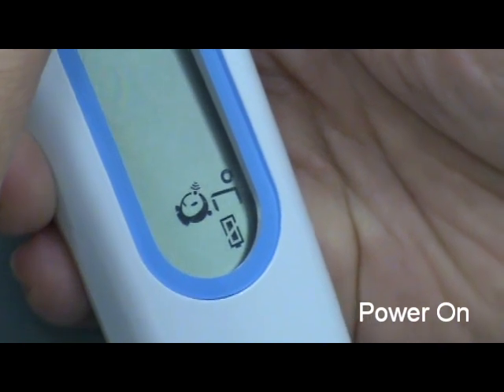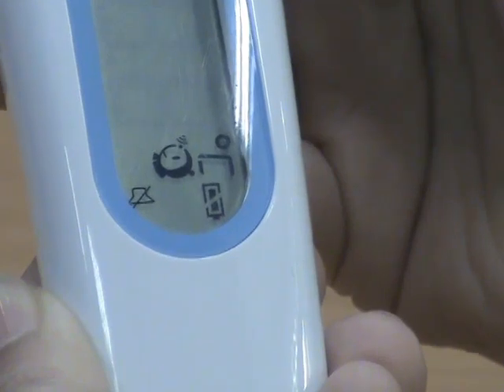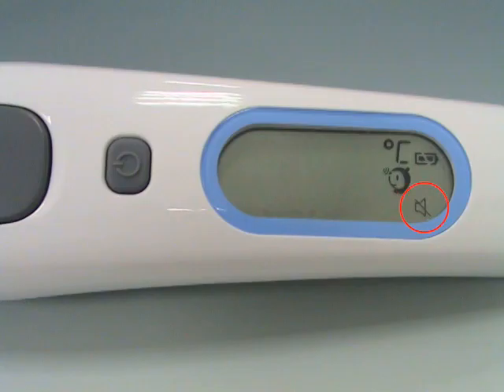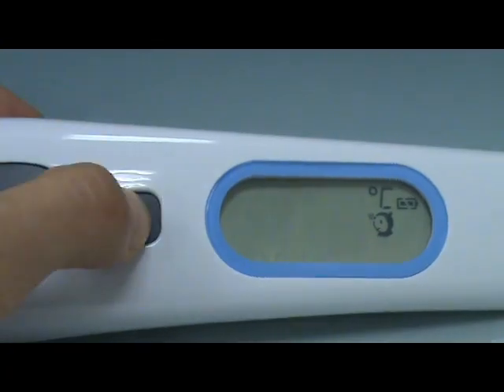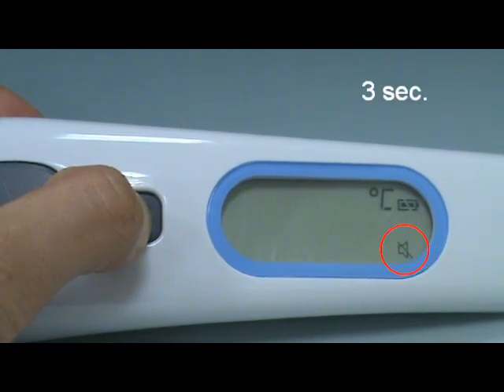The device default setting has the buzzer on. You can set the buzzer on or in mute mode. When powered on, press and hold the main button for 3 seconds. The mute icon will flash on the LCD screen. Then release the main button to set mute — you will not hear a beep sound. You can use the same process to turn off mute. Note: if you keep pressing the main button for 5 seconds after the mute icon flashes, the device will power off without setting mute.